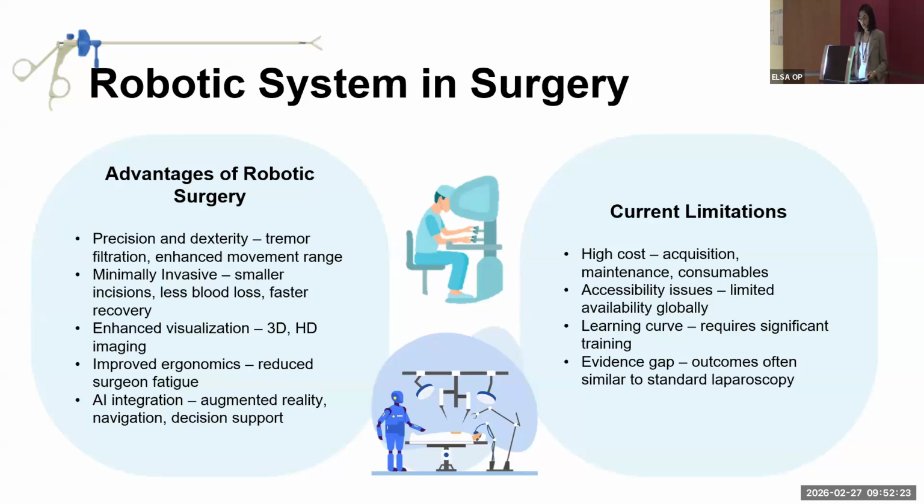Also, the ergonomics is improved with the robot, so there's less surgeon fatigue. And I haven't seen this, but there is already AI integration in the robot, so you're able to teach the surgeon navigation and help with decision making by identifying the structures during the operation.